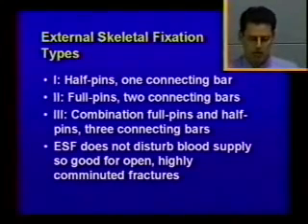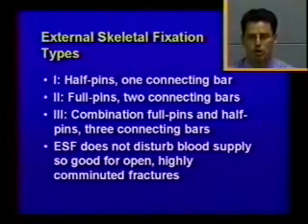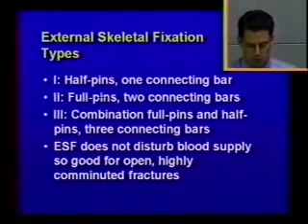A type 3 will be a combination of these two types, so we'll have a type 2 fixator that in the craniocaudal plane will have, for example, a type 1 fixator coming in at a 90 degree angle, and these can be tied in together. So they're all interconnected, and these would have three connecting bars, one cranially, one medially, and one laterally.